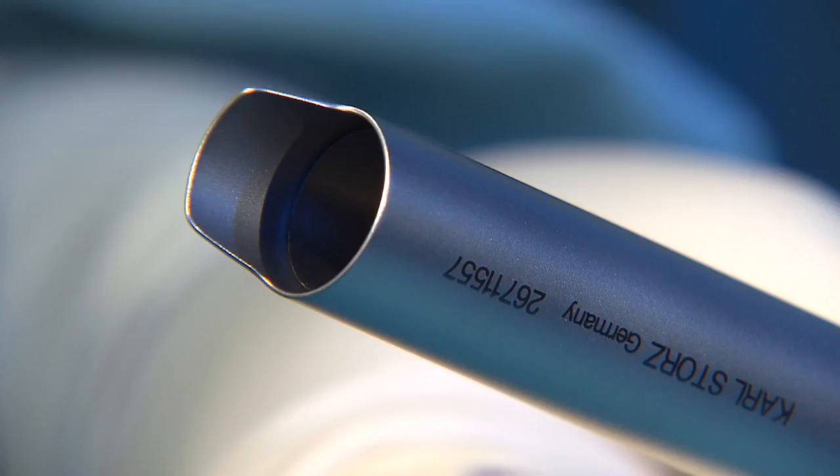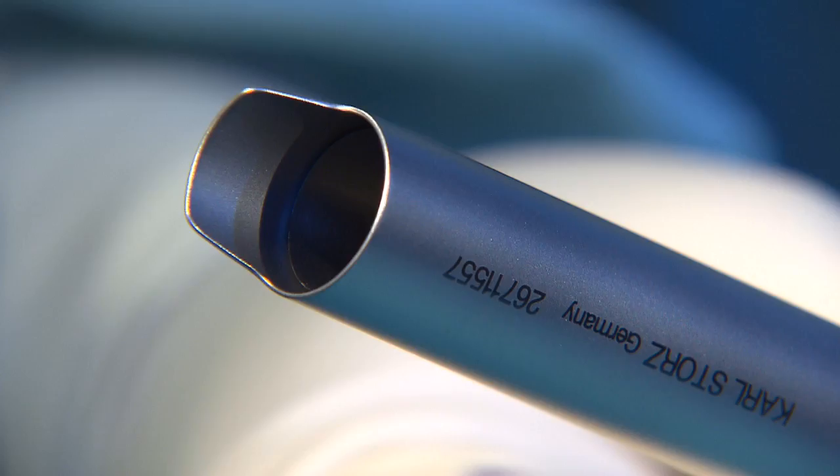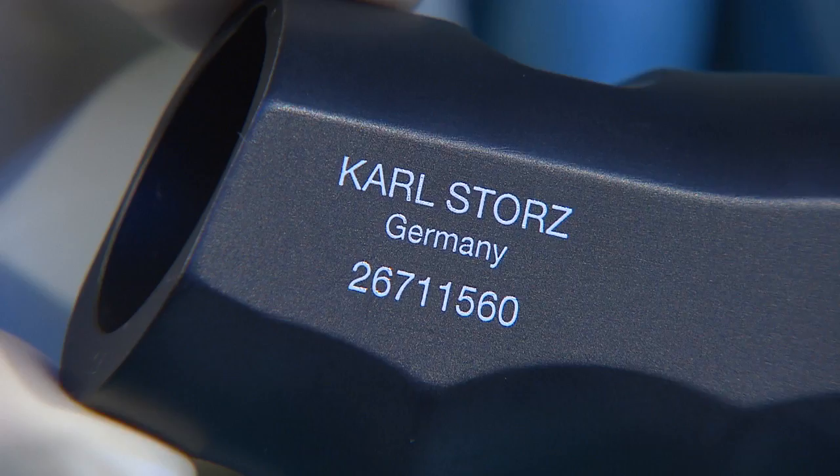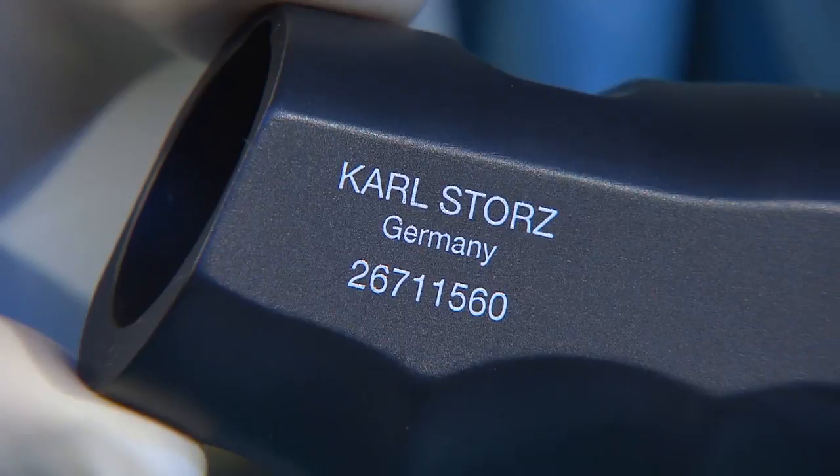With the application of light pressure, the protective tube retracts and the knife projects from the protective tube. The ergonomic handle has a marking showing where the motor is inserted. The motor also features a groove for orientation.